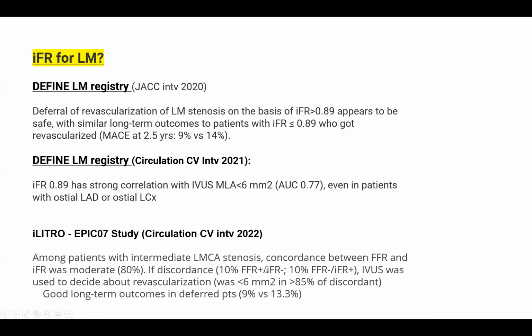So any one of them, so you can do probably in left main, both FFR and IFR. If any one of them is significant, you should revascularize that left main, as most of them were significant by IVUS, okay? And there was good long-term outcome in deferred patients.